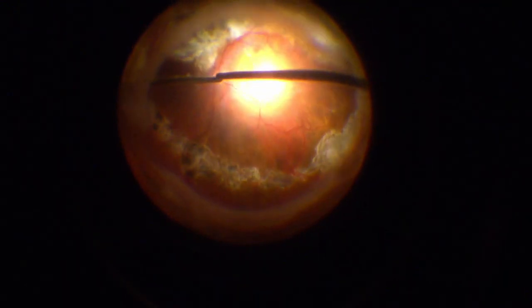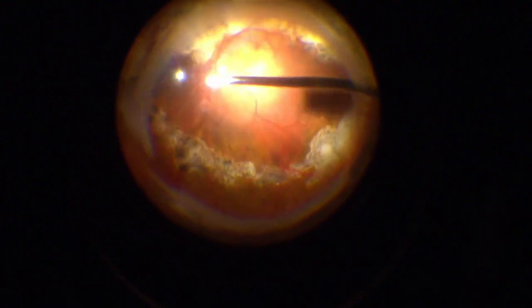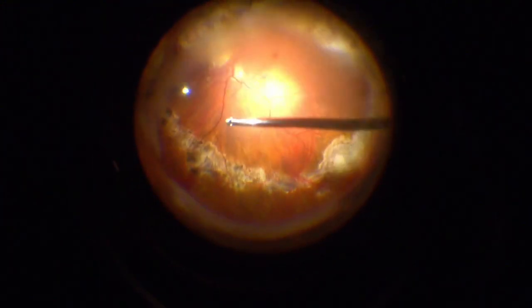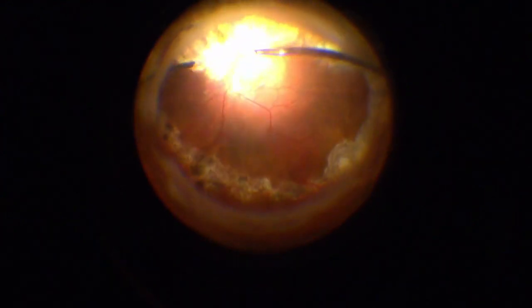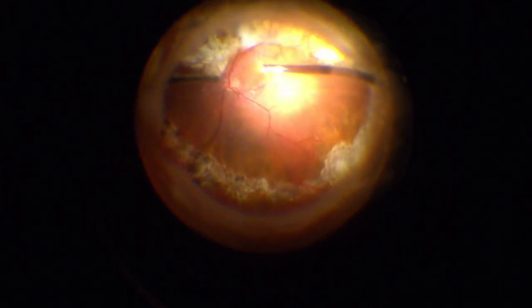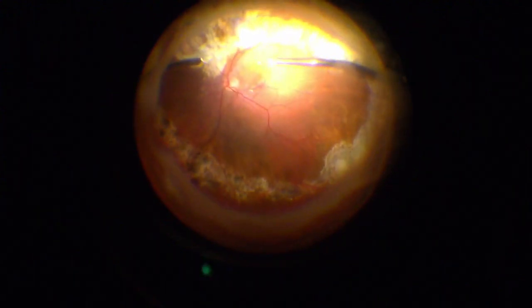So here's our case. This is actually the best view I've had of this eye too, because the view in the clinic wasn't certainly any better than this. You can see the patient's had a large retinectomy, inferior with extensive laser. He's had a 360 retinectomy is what I would tell you. Looks like he had it up here too, and nasally. So the retina is attached. I'm not seeing any detachment.